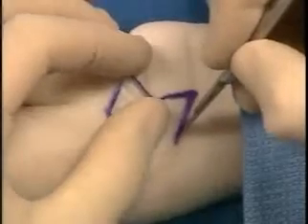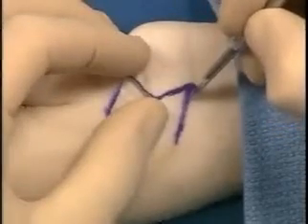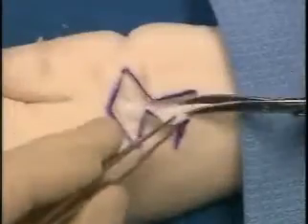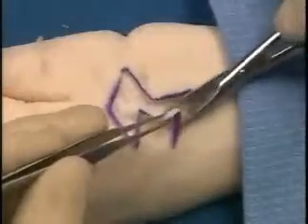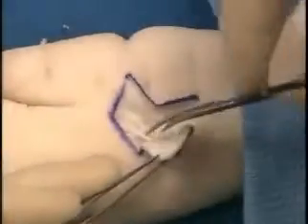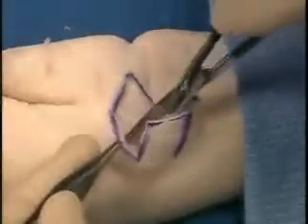And now the incision is made along the superior limb, and now at an angle of approximately 60 degrees, the second incision is made, mobilizing the flap now with a pair of dissection scissors with the tips up. Again, you may use a 15 blade or dissection scissors.